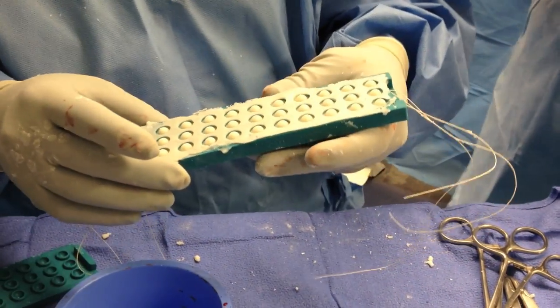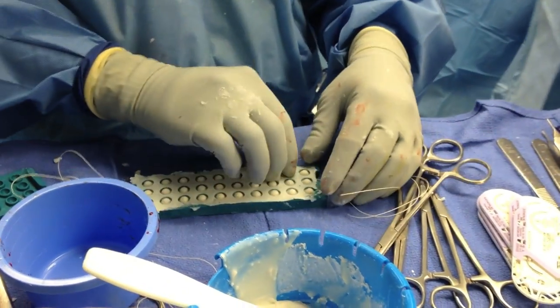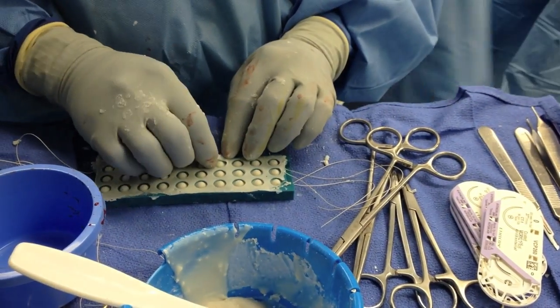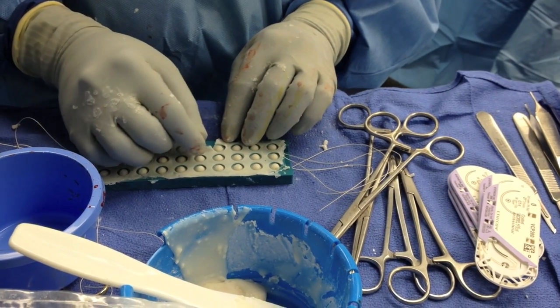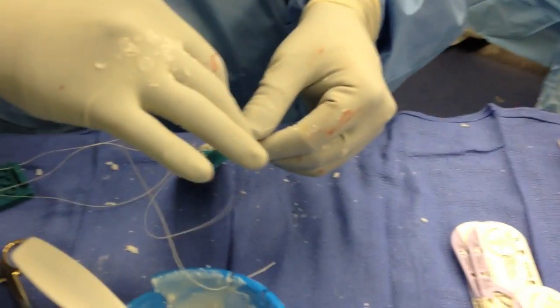After it appears the cement is fully cured, this is evaluated. We take up some of the extra cement from the side — if this is still malleable and flexible the cement is not fully cured. We let this sit for several additional minutes to let the cement balls fully harden.